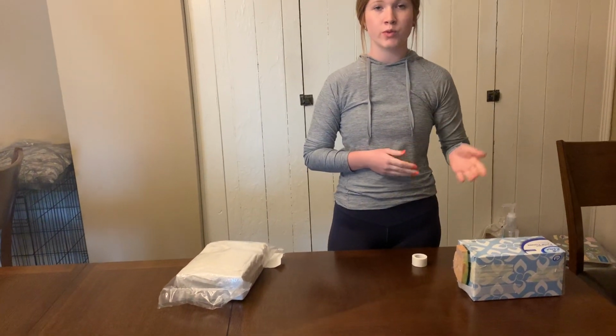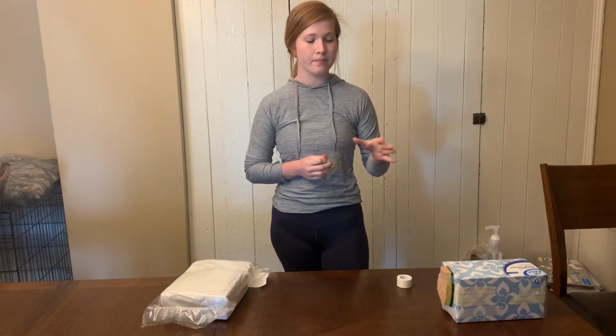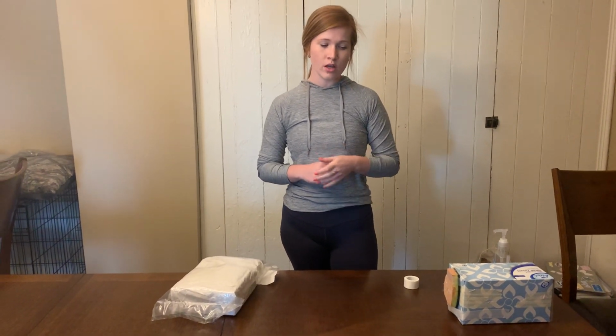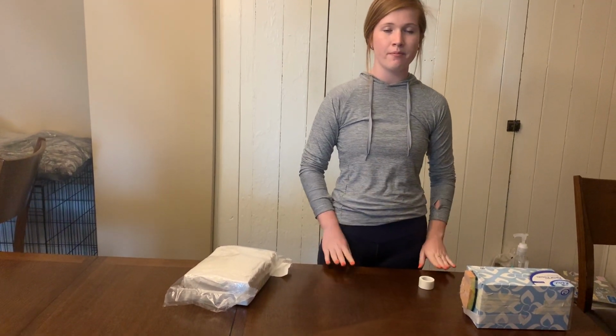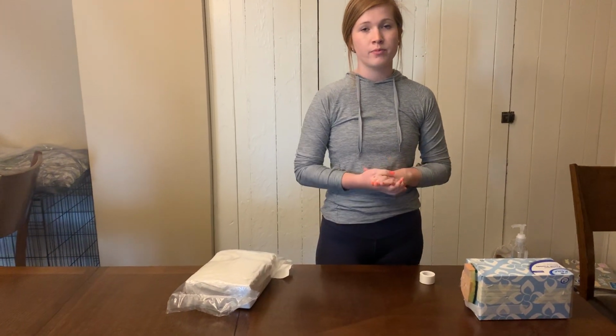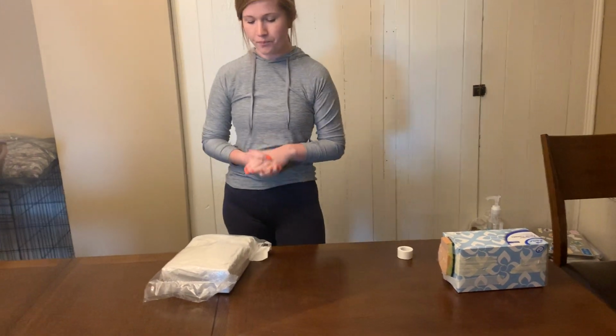I would also assess the bladder for distension or fullness, which would indicate needing that catheter. So once I've explained the procedure, provided for privacy, and set my bed to waist height, I would be ready to open my catheter kit.